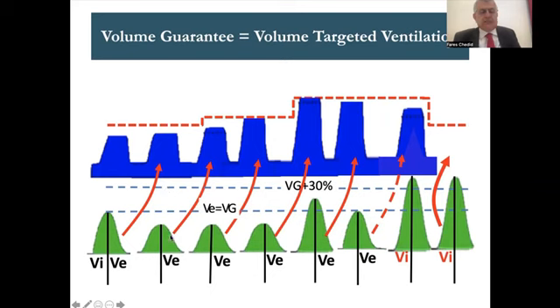But let's say the volume produced was below the target, then there will be an order going to the PIP of the next breath to go up. If the volume is still below target, then the PIP will go up, but it cannot exceed the PIP max. The PIP max is set 3 to 5 above the PIP that we measure on the patient for safety. So when we reach the PIP max, we cannot increase the volume anymore, here we see the volume is low, unless the clinician goes and increases the PIP max further.